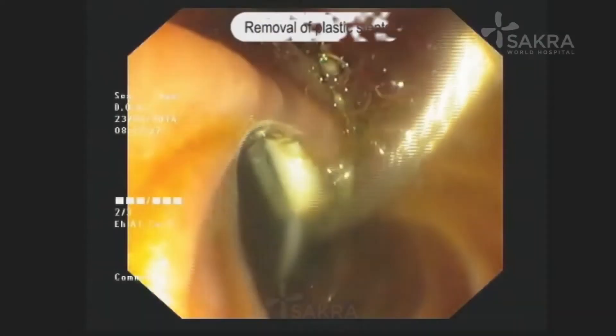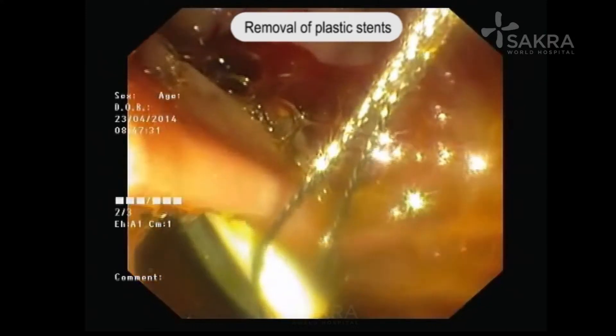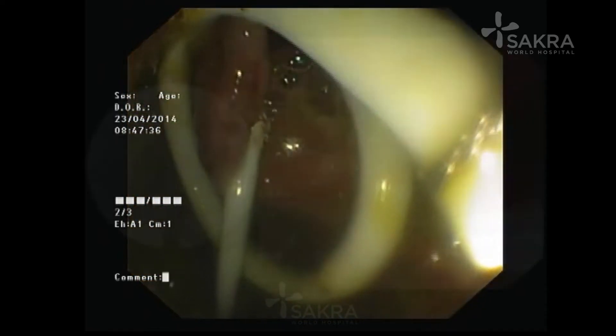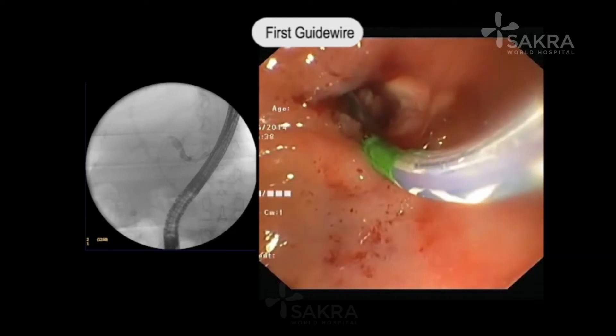This is a patient who had a hilar block due to a cancer of the gallbladder. He was initially treated with multiple plastic stents, and now in the video the plastic stents have been removed and we are recannulating.